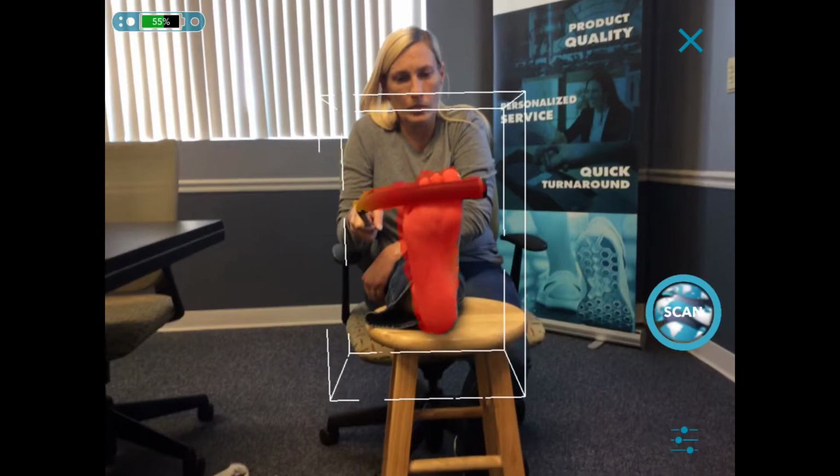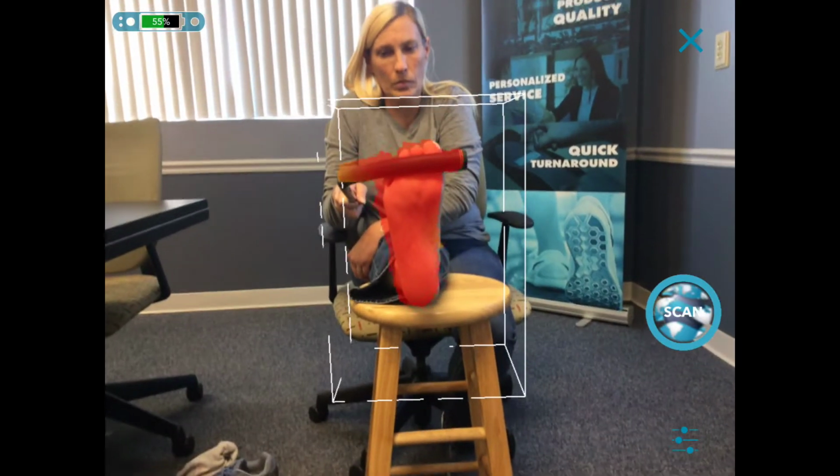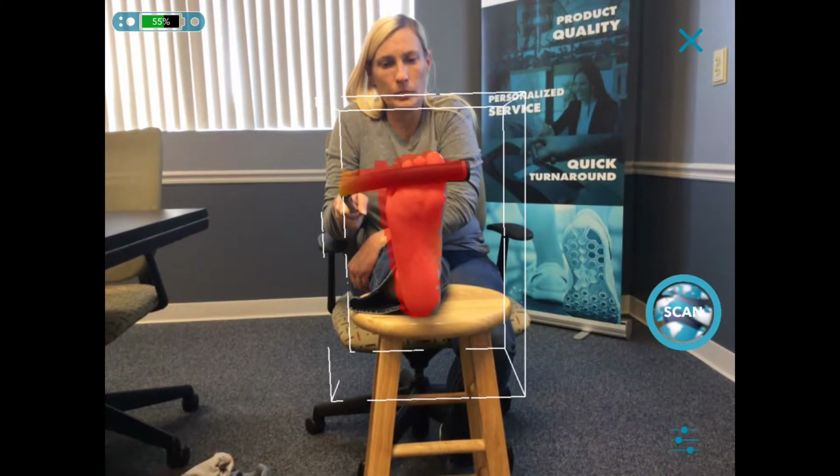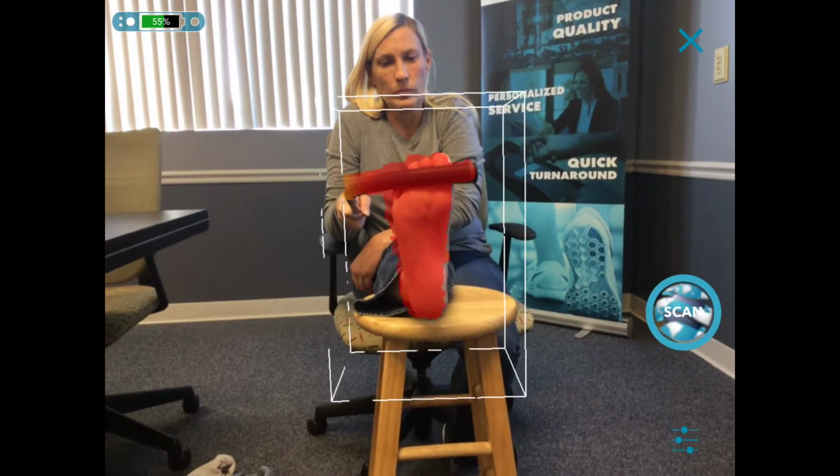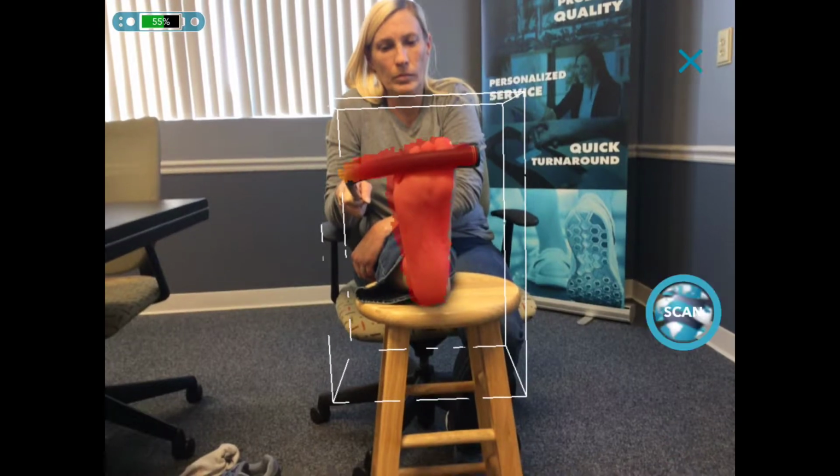You want to make sure you keep the iPad parallel to the plantar surface of the foot. That helps get a nice even scan. So once you're comfortable with where the foot's placed inside the virtual box, go ahead and tap the scan button.